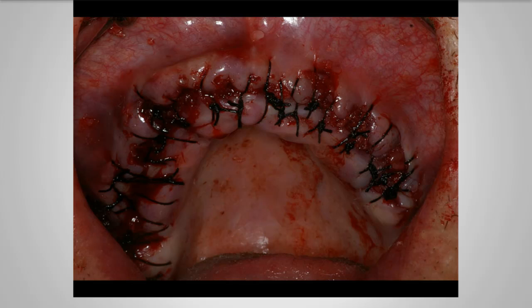One thing that we didn't capture on film that I will routinely do is, once these teeth are extracted, we will use a curette and clean out any areas of tissue, of cystic material, and then we'll go ahead and take our AMD laser, the Picasso, and put it on a setting of about 1.5, very similar to the setting you use when doing periodontal therapy, and we sterilize that area as much as possible with the laser. Without causing burning or cauterization, we're essentially disinfecting that area.